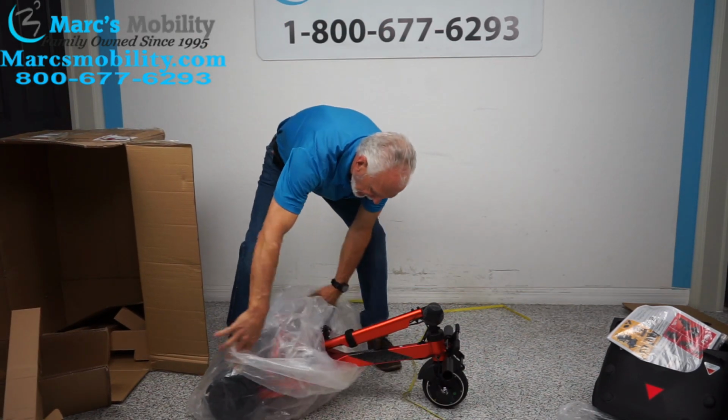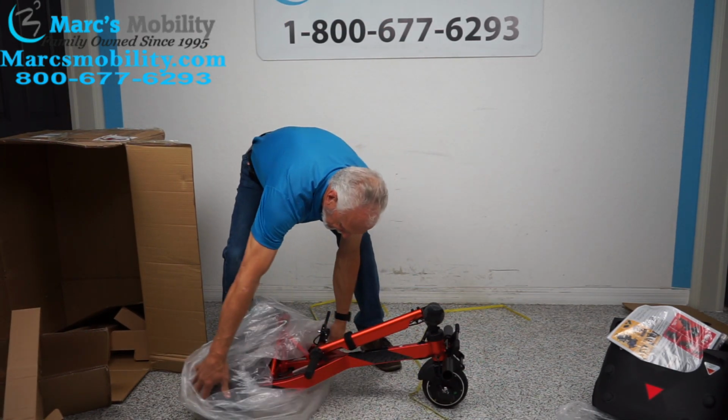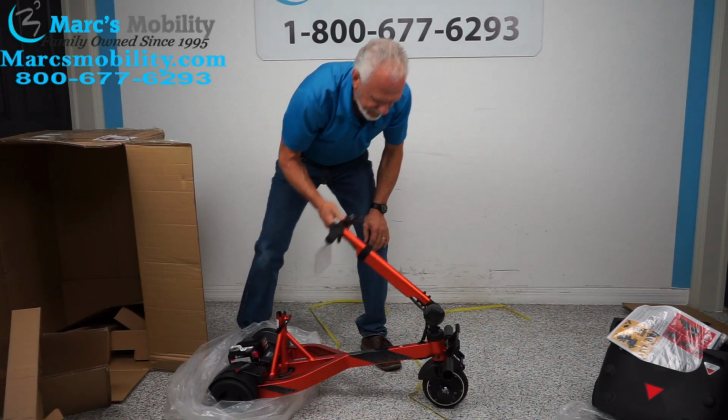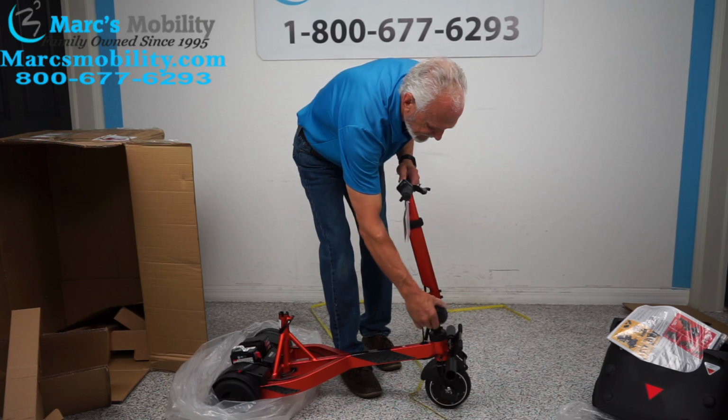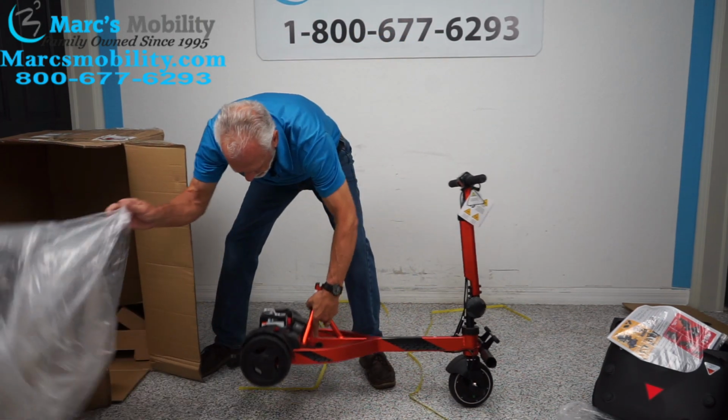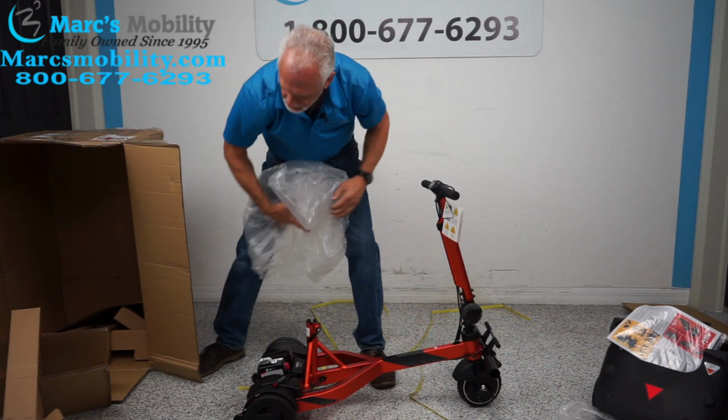So what you would do now, you would just take the plastic off the chair like this. You would raise this up, and now you have a little adjustment here. The battery is already installed here.